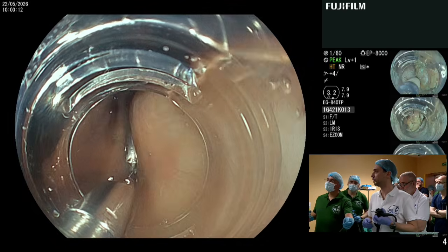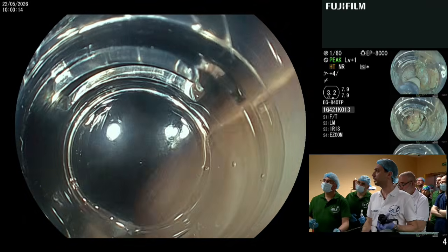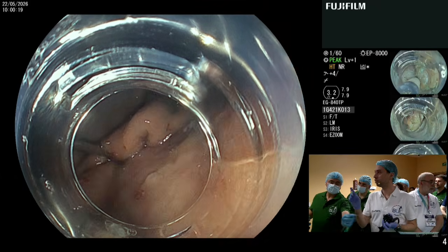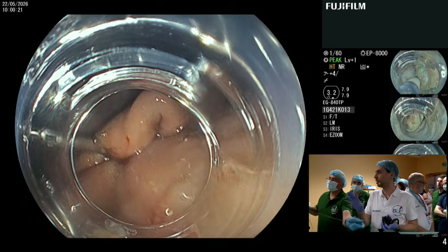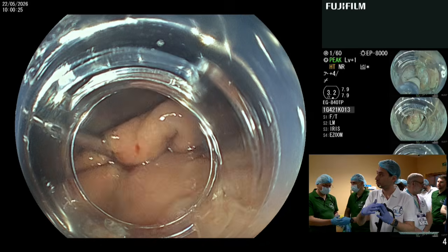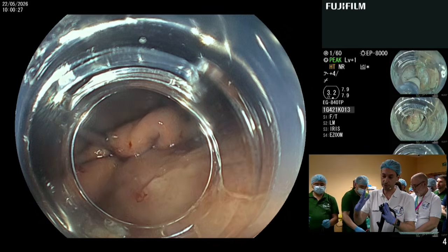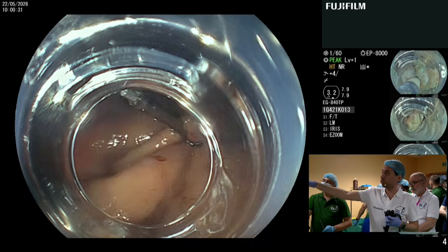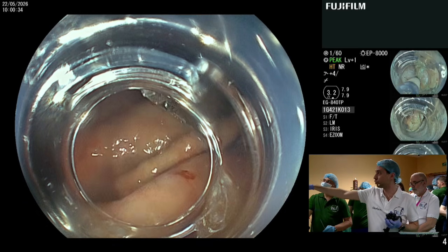Now, you have to open again, all right. So, what we have done now, with only one clip, we have almost closed the defect. We have approximated the two edges. Normally, we have to use 4 additional mantis clips just to be safe.